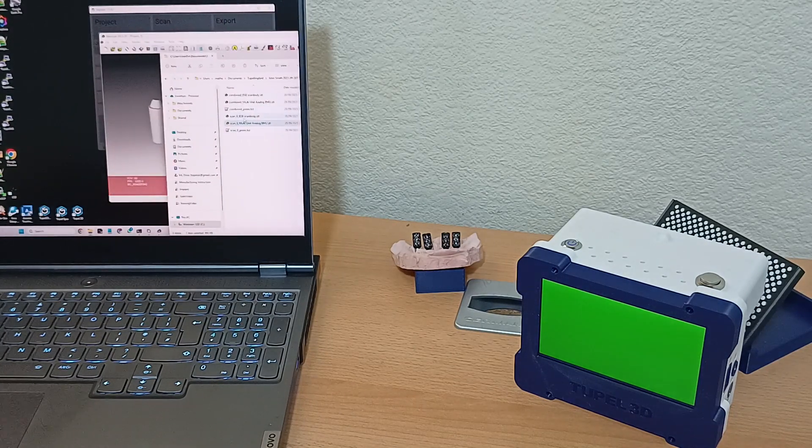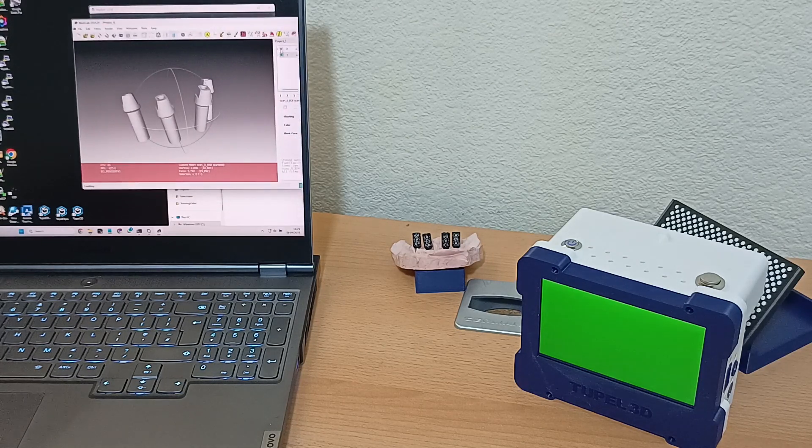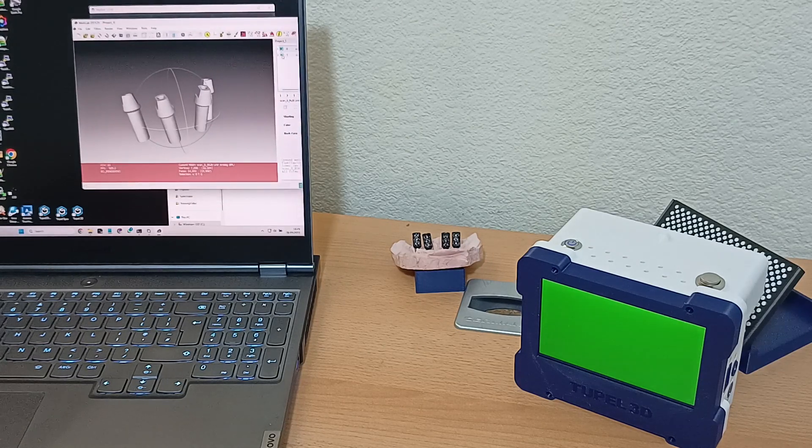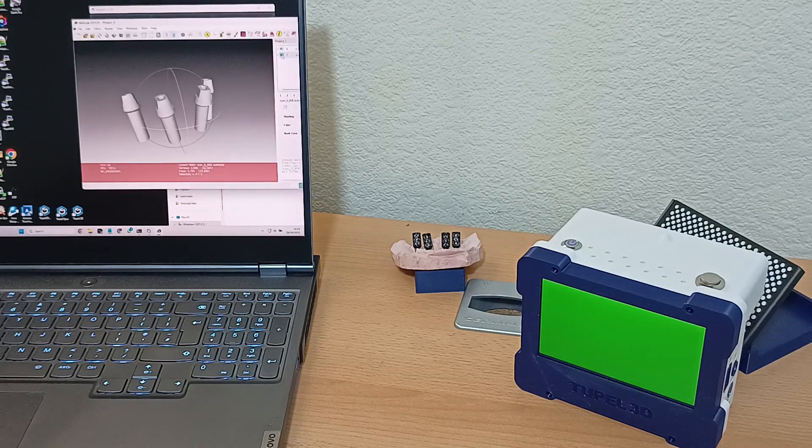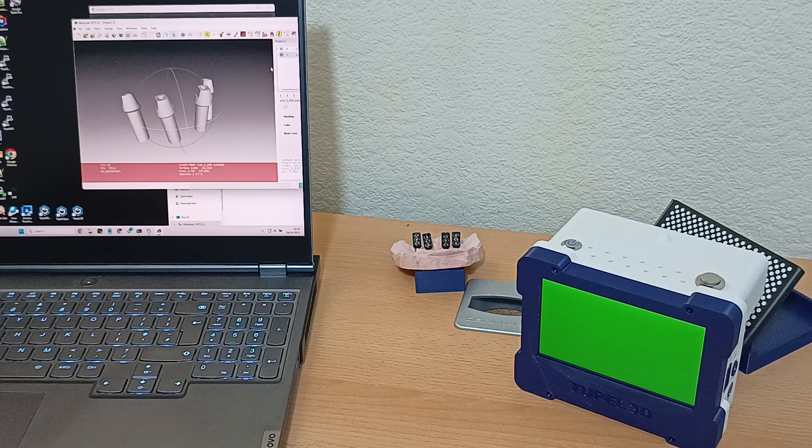Note that we also exported CAD files of scan bodies. So now we have highly accurate STL files of where scan bodies actually should be, and this means you can register our data with your intraoral soft tissue scan too.